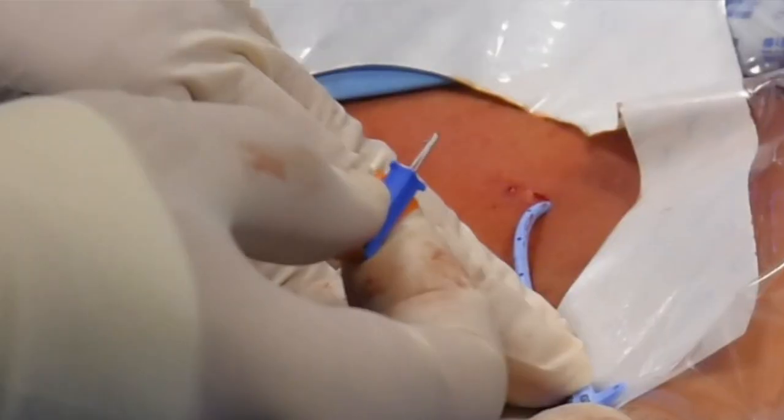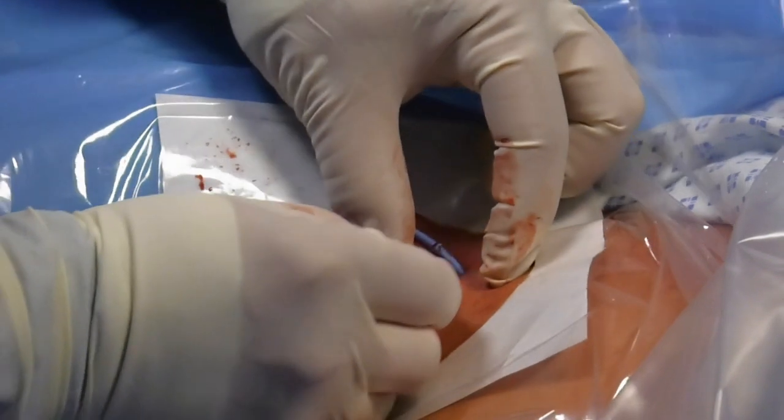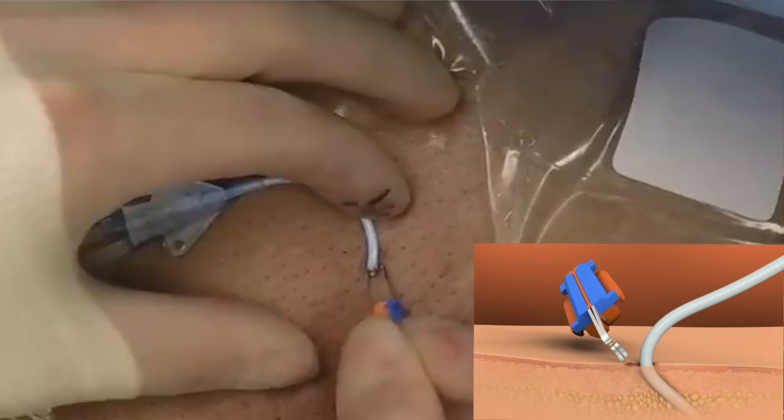Fold the SecuraCath base until the feet come together. Lift the catheter to visualize the insertion site. Apply traction to the skin to help dilate the opening. Grip the folded base with two fingers and a thumb.